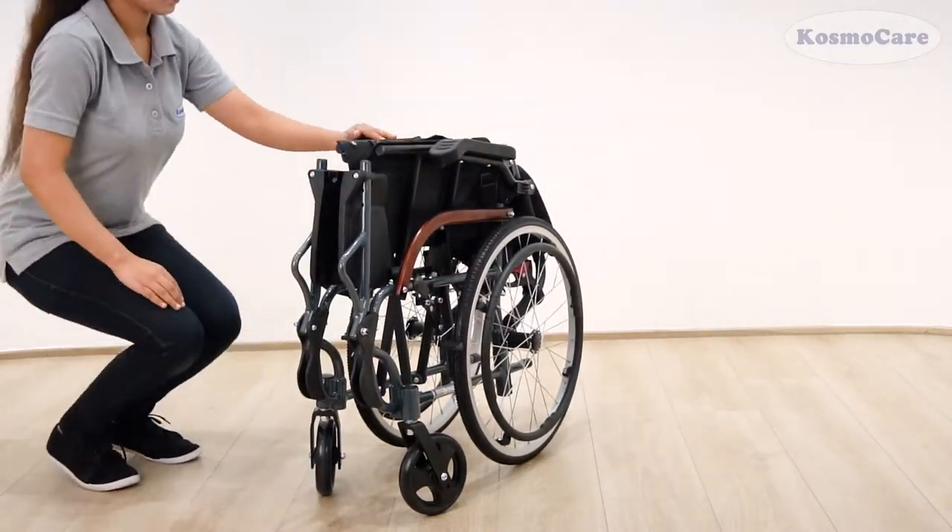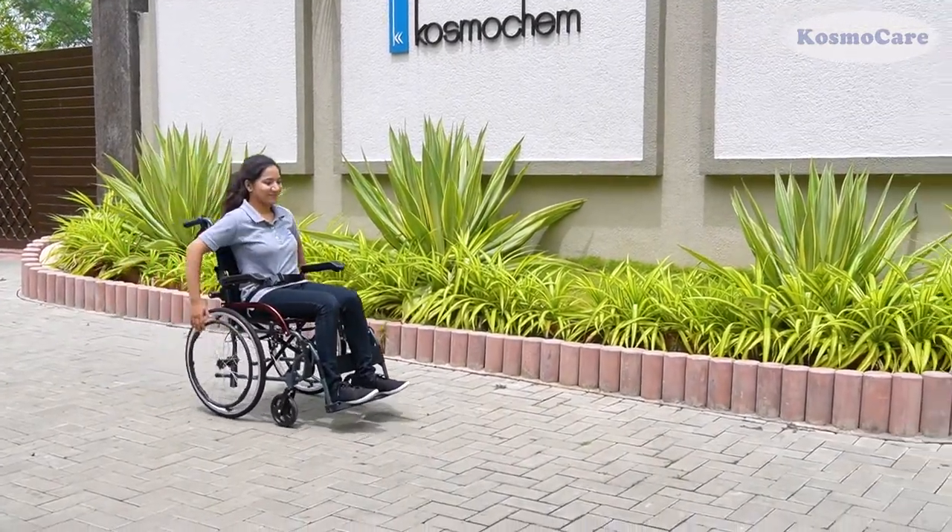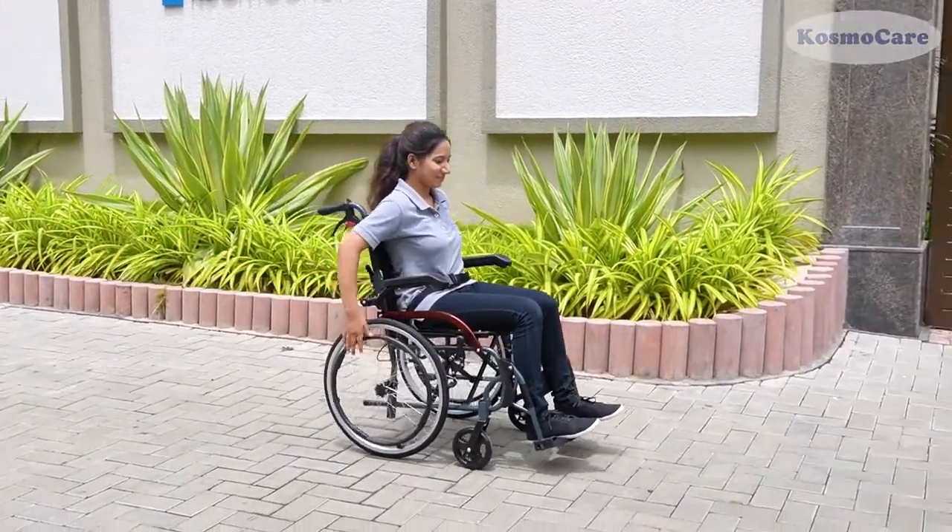So, give your loved ones the convenience and freedom they deserve, with the Elegant Desire Wheelchair from CosmoCare.